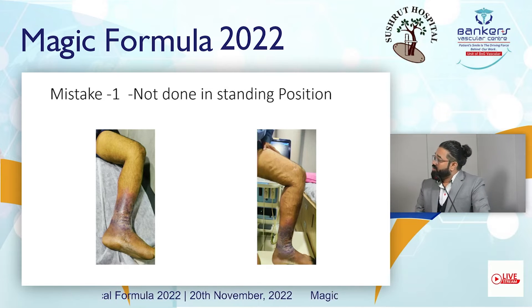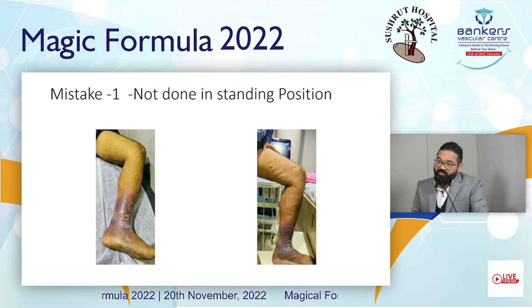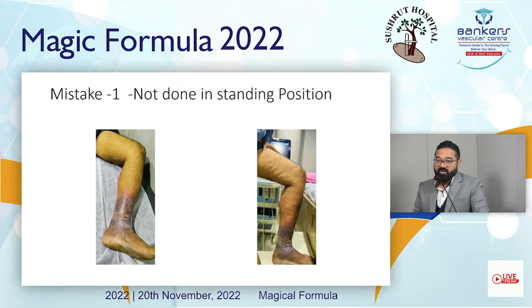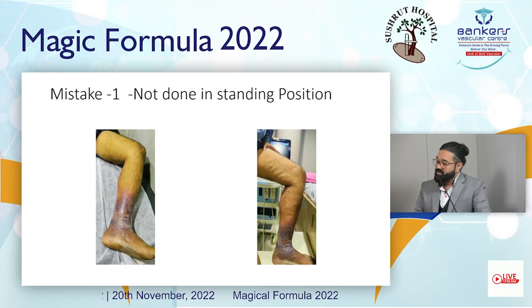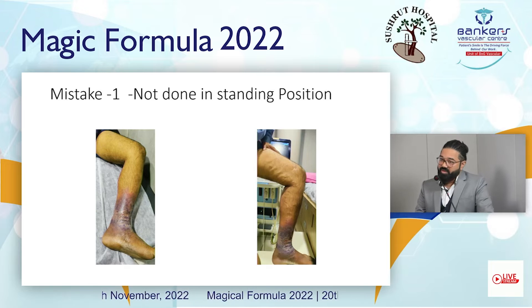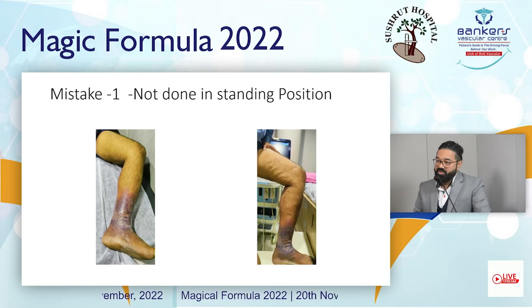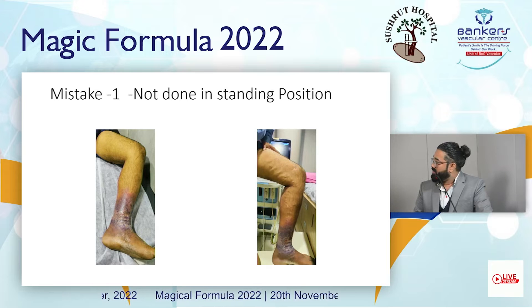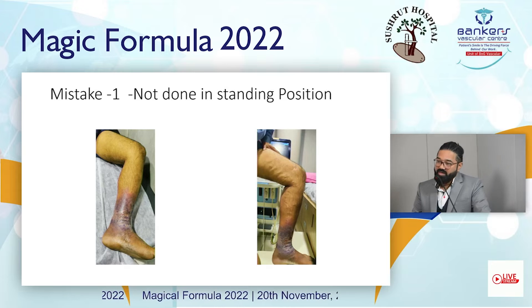You can see there are no obvious dilated veins visible in the lying-down position. However, in the same patient examined in the standing position, there are varicosities in the thigh and leg region.